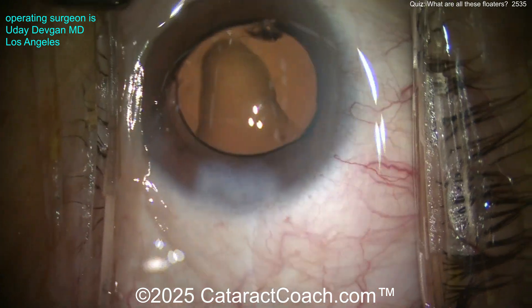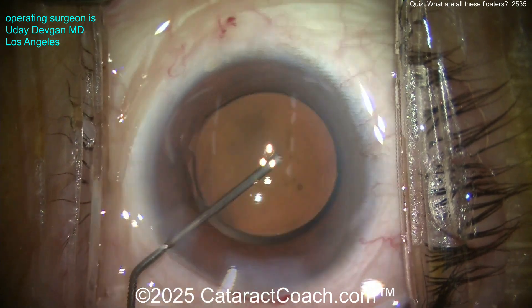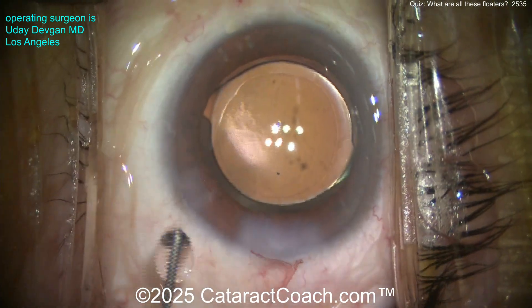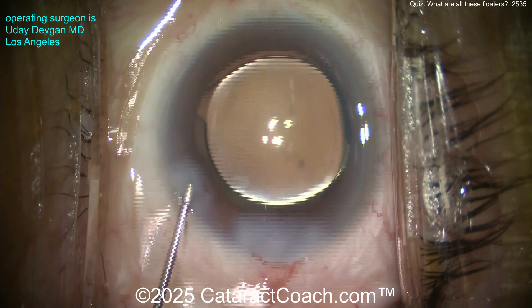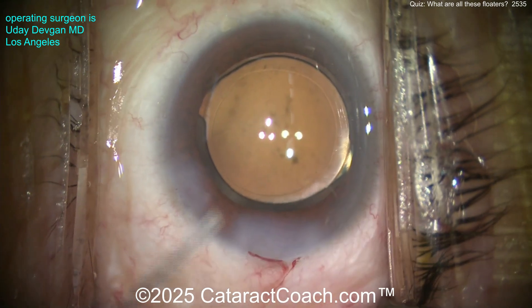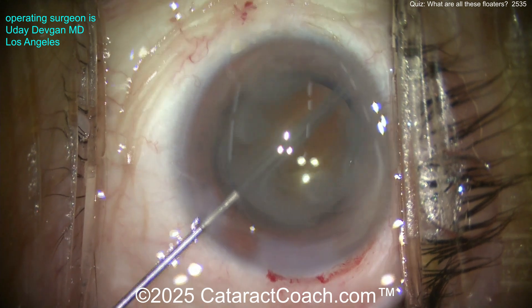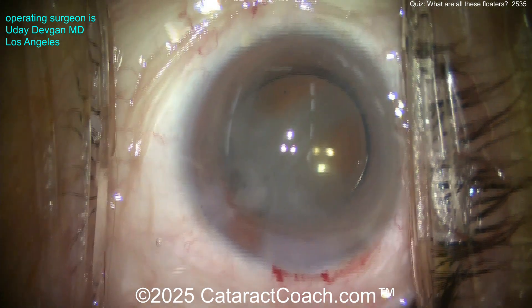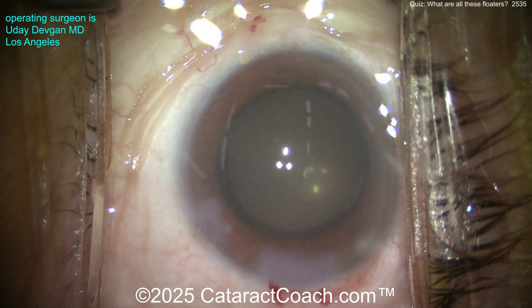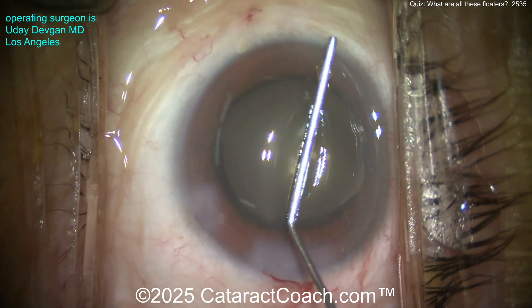This is going to be fine; the patient is going to do great. Remember, this is not the same as the patient's pre-existing vitreous floaters. The lens is beautifully centered — nice-looking rhexis, by the way. Now I'll put in saline to seal up the incision and inject some triamcinolone, preservative-free, about one milligram into the anterior chamber. We'll wash this around a bit with BSS — that's probably enough. Let's seal up the incision and call it a day. This patient is going to do just great.